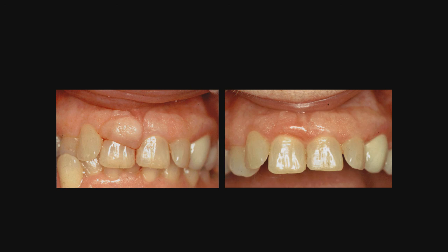This is where we started. This is the way she looked 3 weeks later when she came back. And in looking at this slide, unfortunately, in the papilla area, we still have a thick biotype. And I wish I had thought to go in there and festoon that area and thin the area, for I think we're going to get some level of rebound.